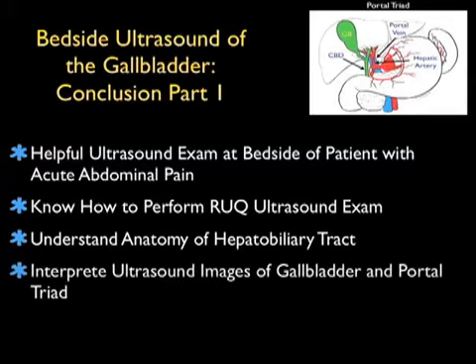And also, by going through the footage, looking at the ultrasound imaging of the gallbladder and portal triad, you now know how to interpret the ultrasound images that you will obtain at the patient's bedside.